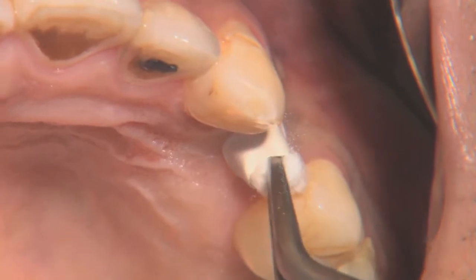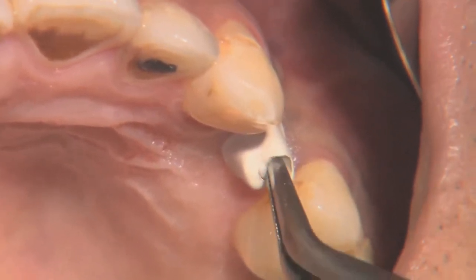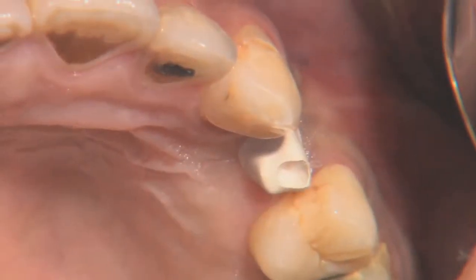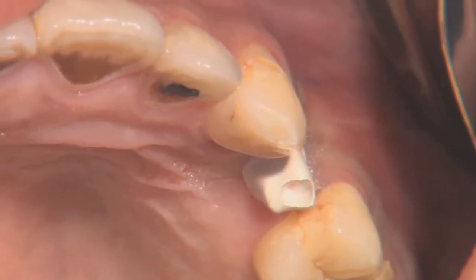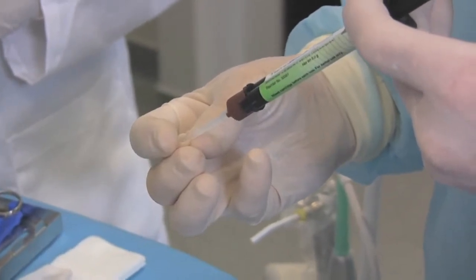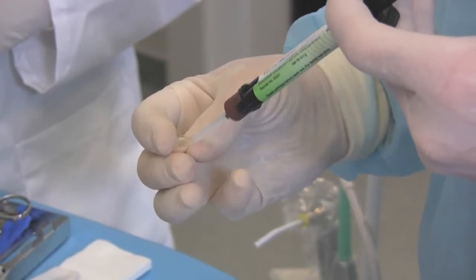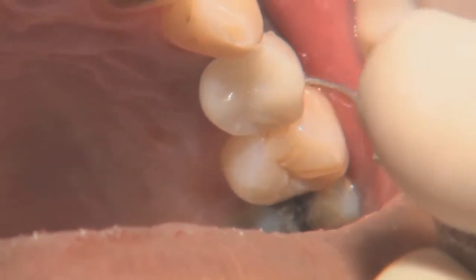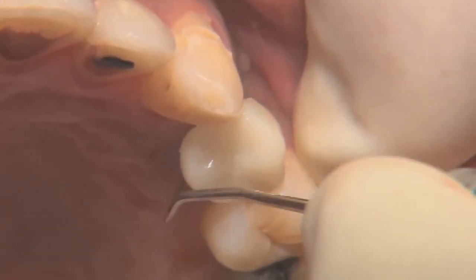The sculpting of the soft tissue to conform to the anatomically shaped final abutments and crowns through placement of custom-milled temporary abutments begins as soon as the implant is sufficiently stable, either at the time of placement or after initial healing. It's no longer necessary to wait until the implant is healed to learn whether an aesthetic final result can be created. We as dentists can now feel comfortable in advance that we will get ideal aesthetics.